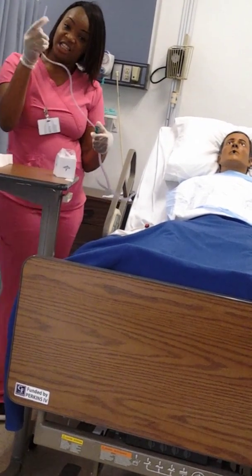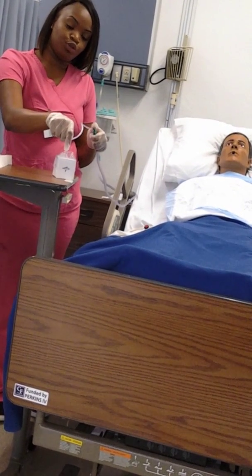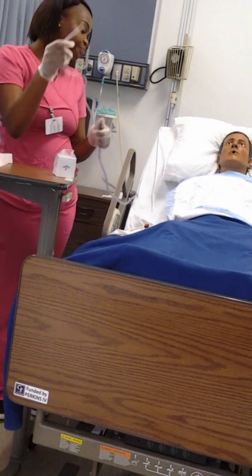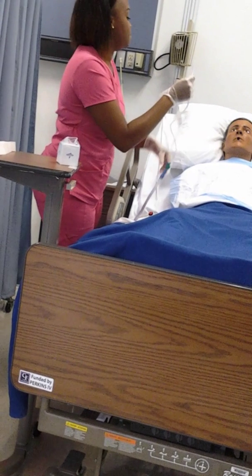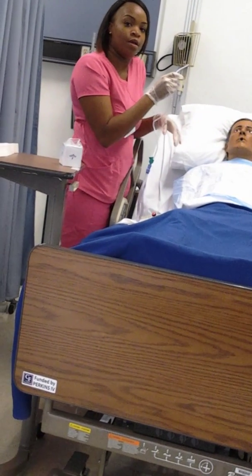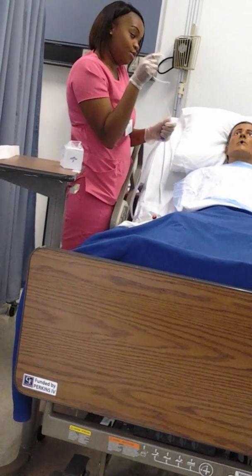I'm going to go ahead and check the equipment to make sure that it's working. I'm going to go in and suction a little bit. It's working. Nasal cannula is off. The nasal cannula is off, so now I'm going to go ahead and go in.